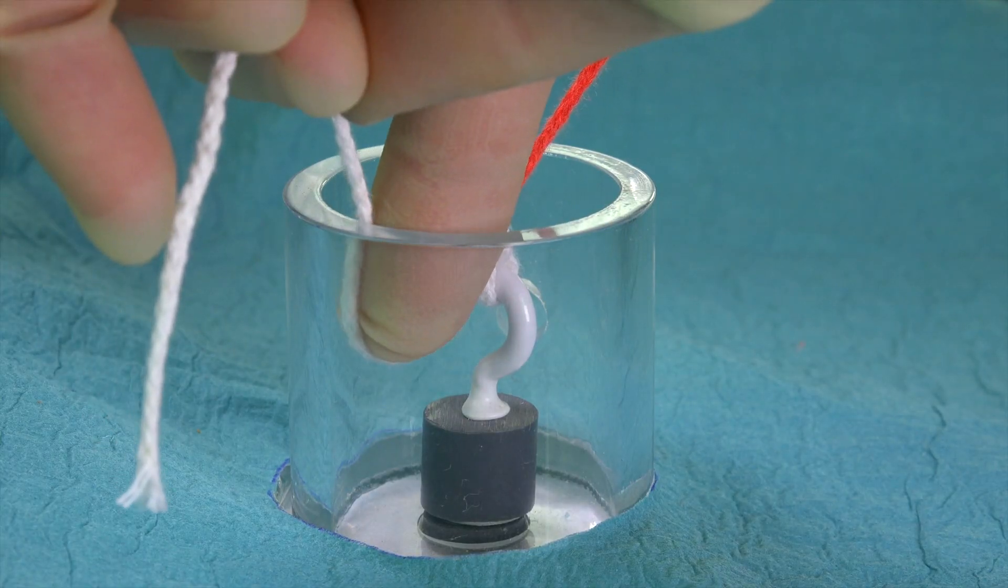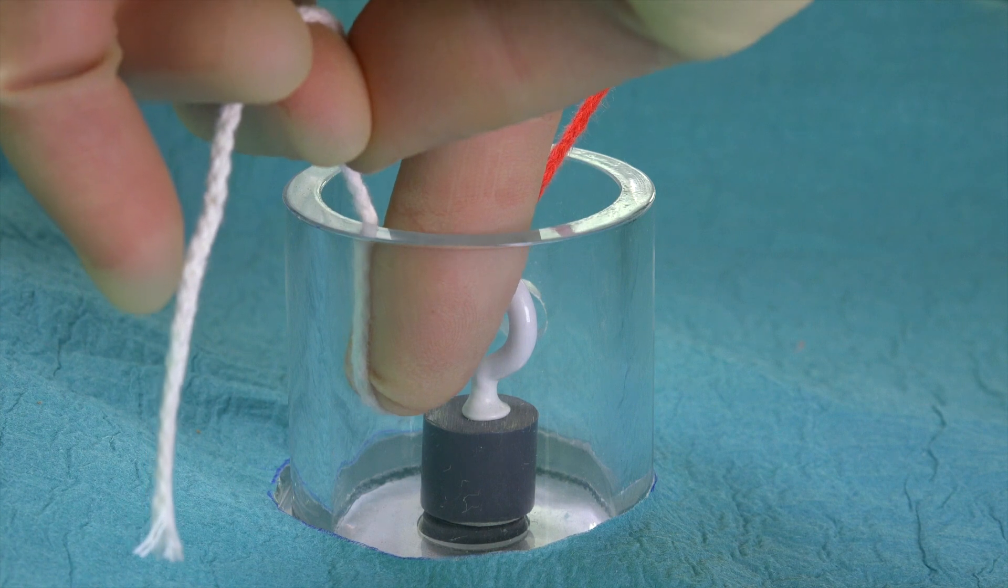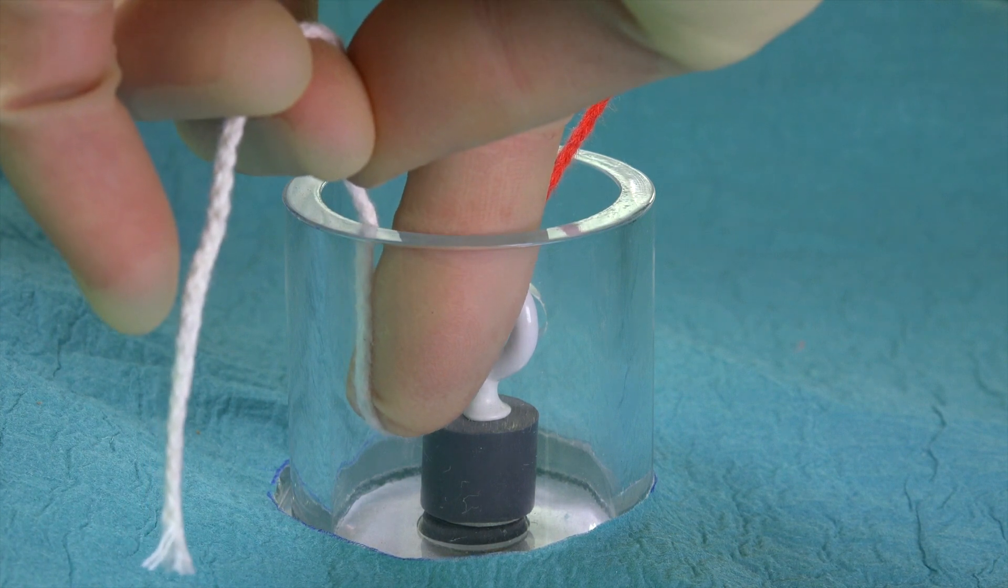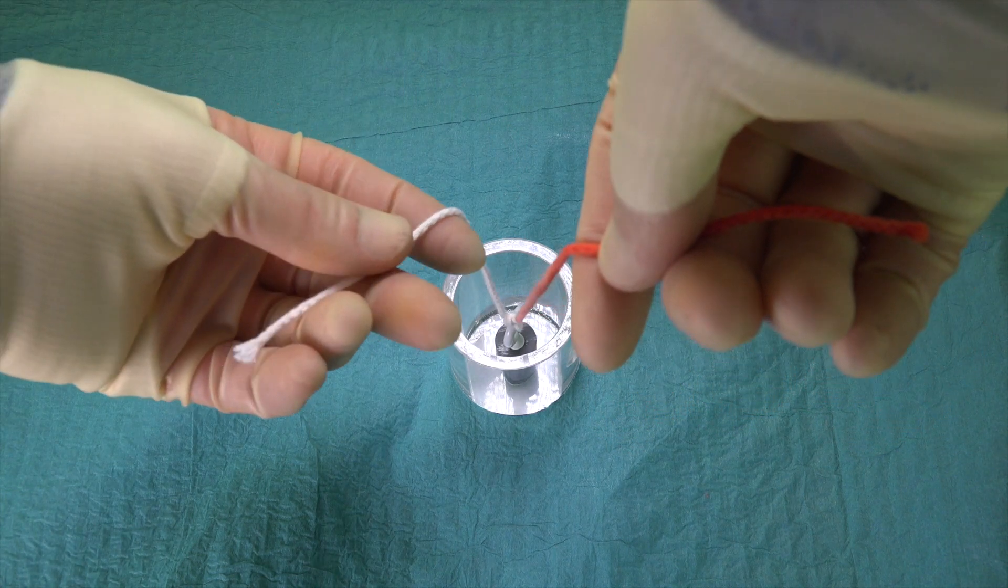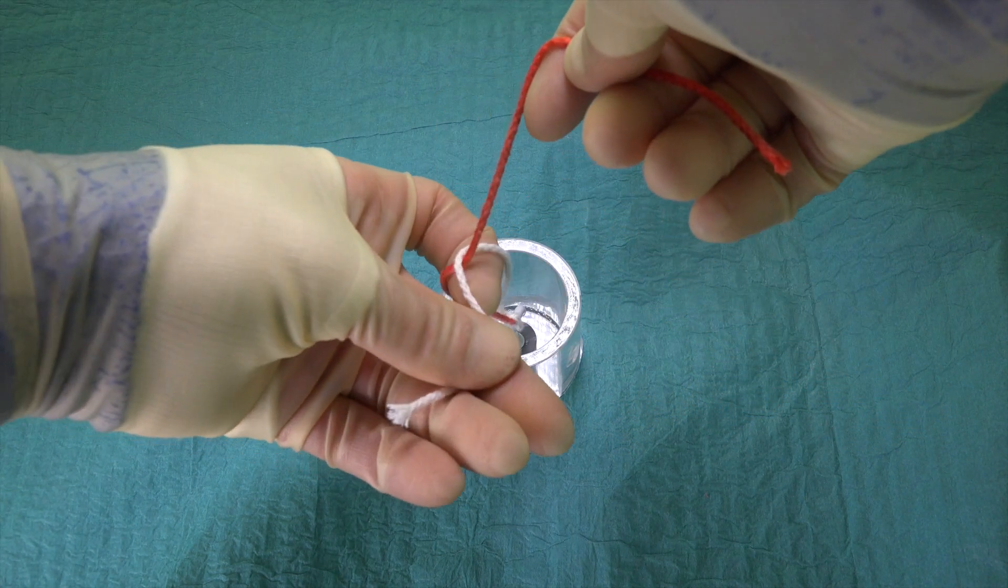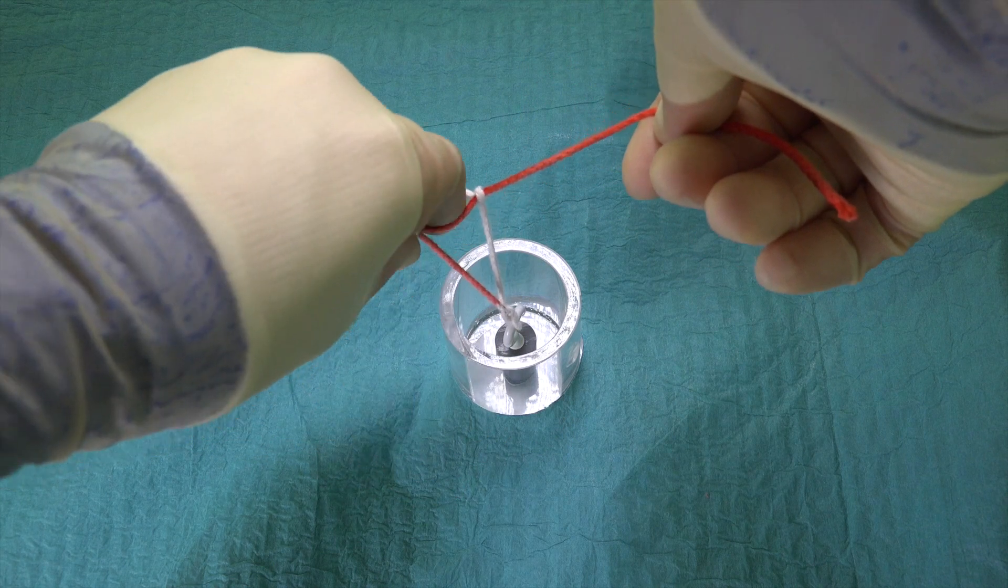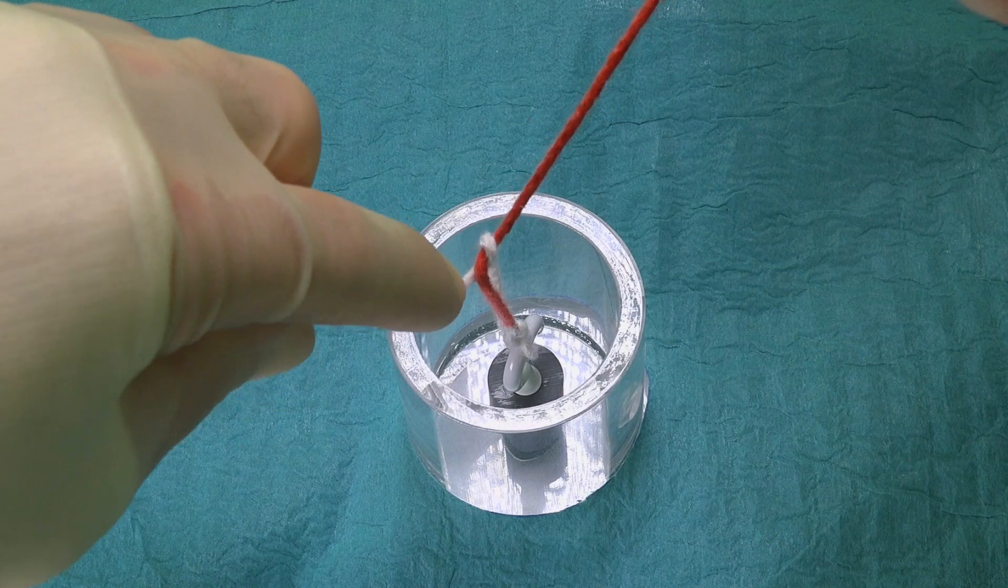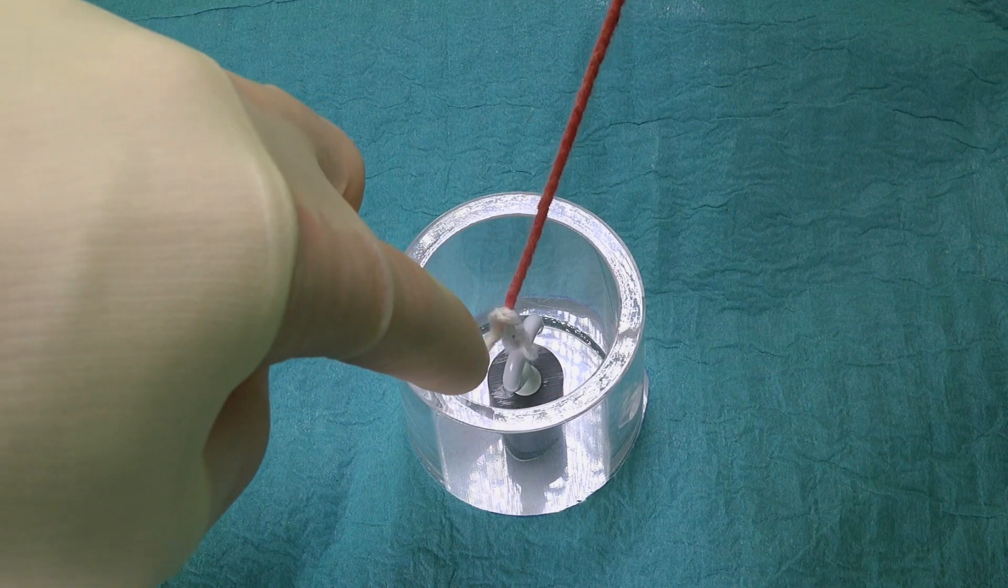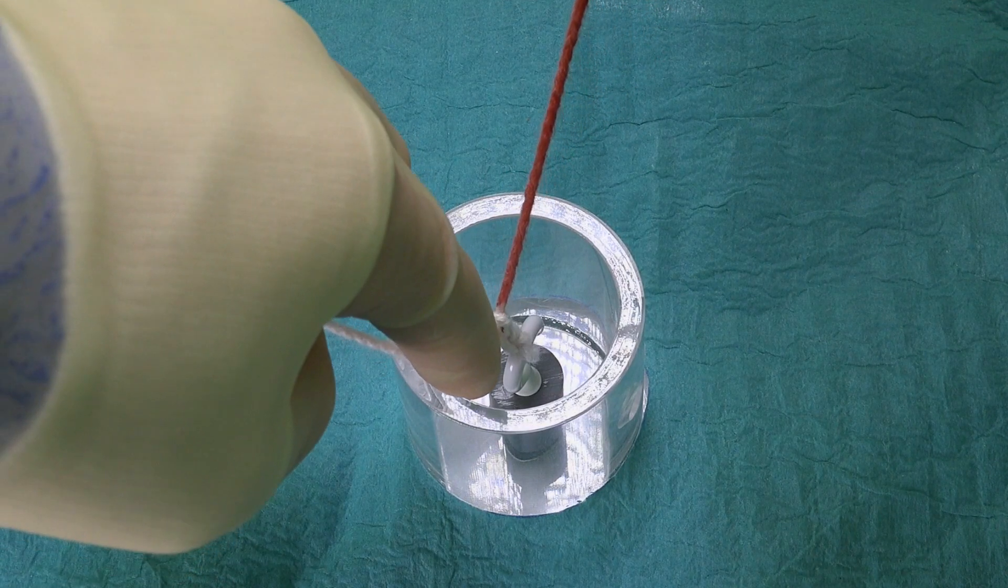The second throw is then laid down, again using the left index finger to press beyond the hook to ensure that the reef knot is snugged down and secure. We then repeat the same actions as we did for our first throw, again maintaining upward traction with our right hand. As we snug what is in this case our final throw, how many throws you need to perform will be dependent upon the type of suture material being used.